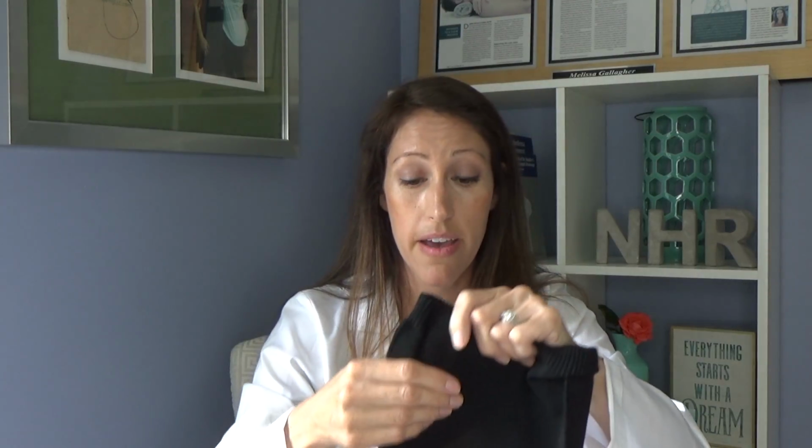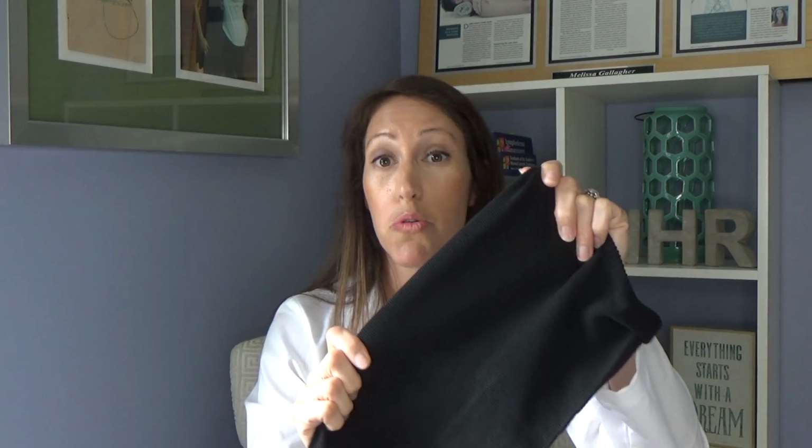And a lot of times the actual threading has silver in it. So it's great for any type of wound care that we're going to be managing, open wounds, even weeping for folks that have the vascular insufficiency and the edema and some of the eczema related to the open wounds, and that we're getting the dermal damage from a wound perspective. This is the beginning. So you'd actually be slipping this on your leg, and then you'll be wrapping on top of that. There's really two core layers to compression therapy.